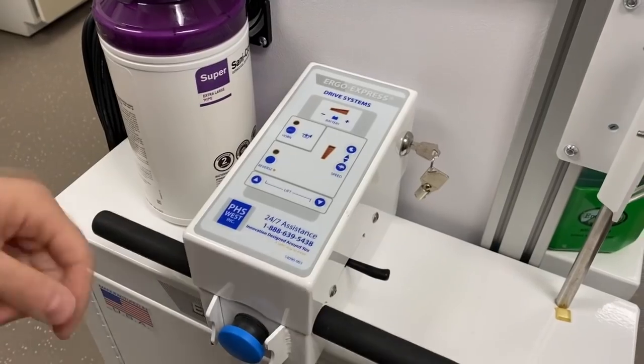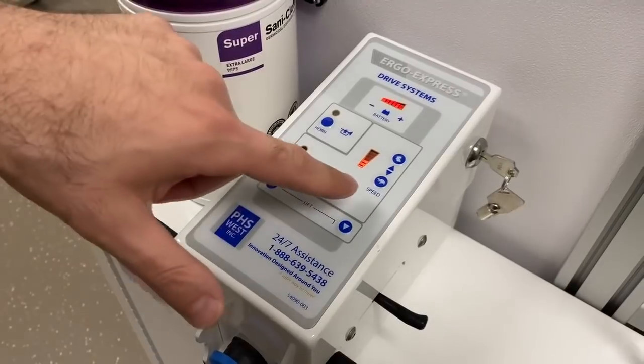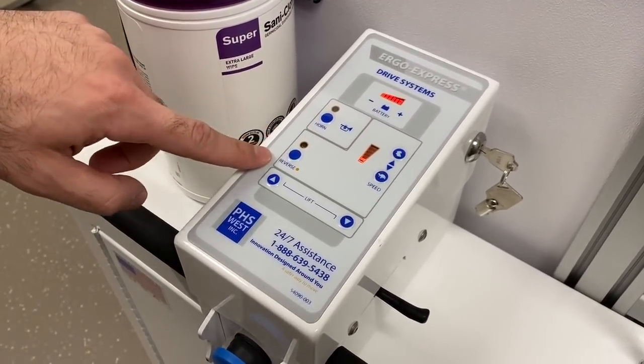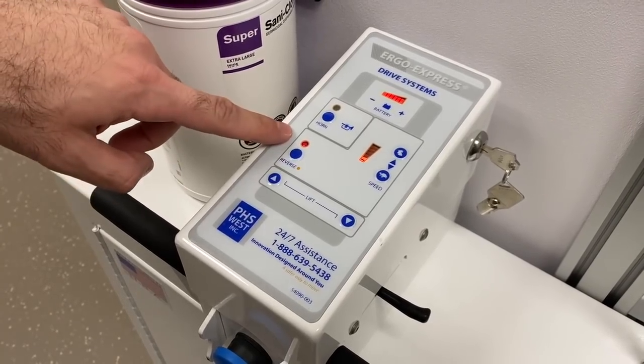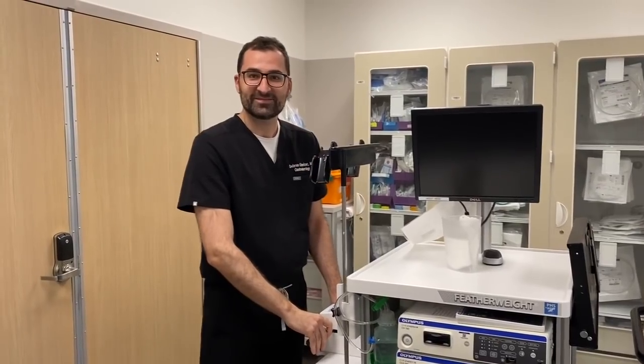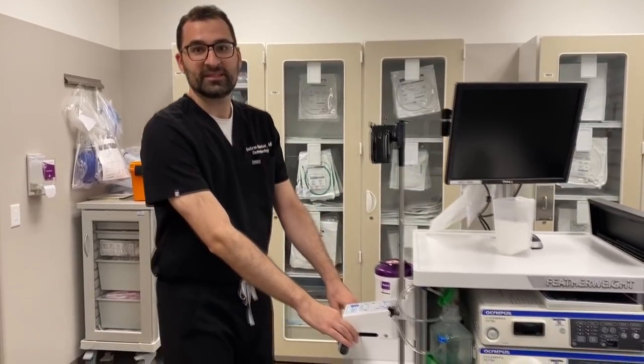So how do we move it? This is the key — this is how it turns on. This is the horn. This section is the speed: that's higher speed, that's lower speed. Reverse if you want to go backwards. Turn this on, light comes on. This is going forward — this thing can move pretty fast, so you've got to be careful. This is reversing, especially when you're going backwards.